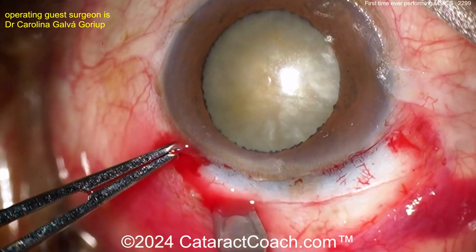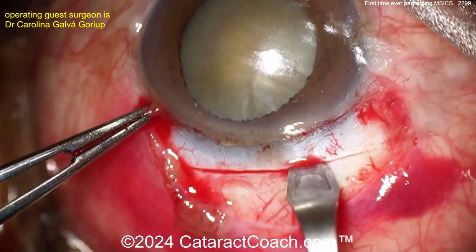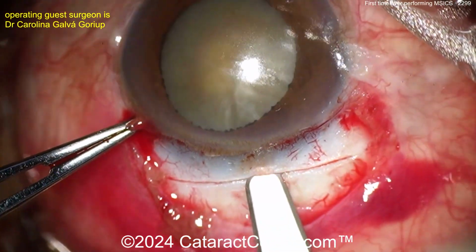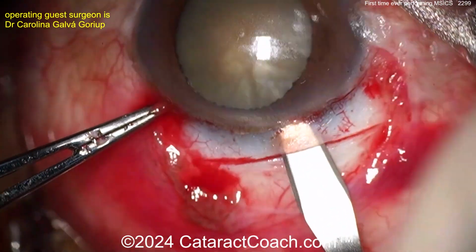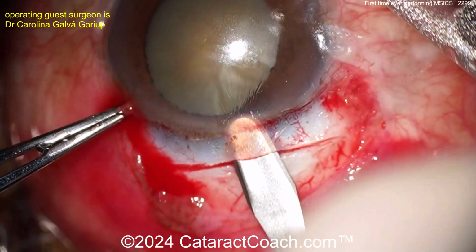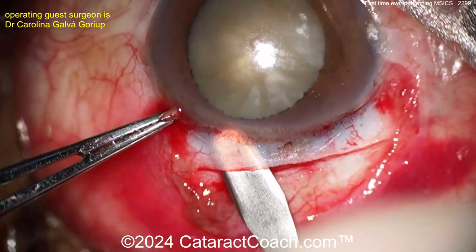You can go both directions. It can be 1.5, 2 millimeters back. And now you've got to tunnel into that half scleral depth into the cornea. Now don't enter into the anterior chamber yet. Advance this and create that shelf with the tip of this crescent blade going into the clear cornea. So you're also causing like a little splitting of the peripheral cornea. That's what you want here. Good job. Very nice going in that one direction.